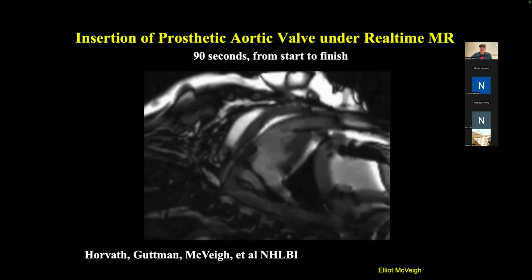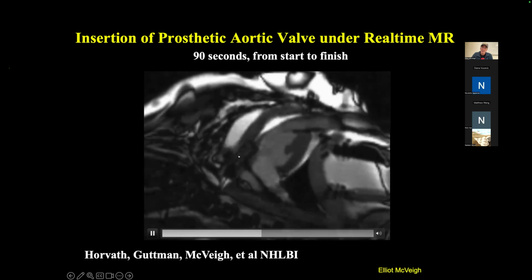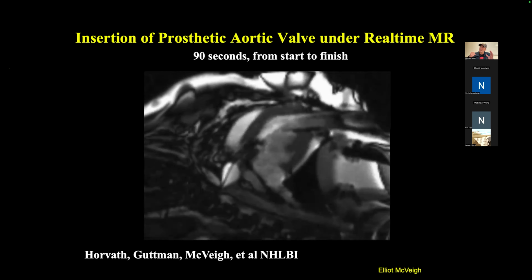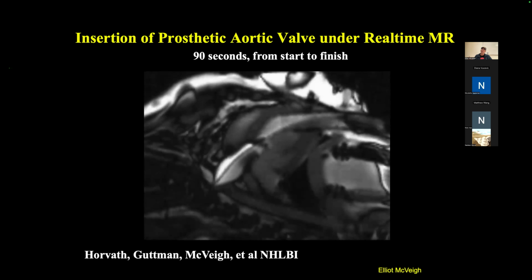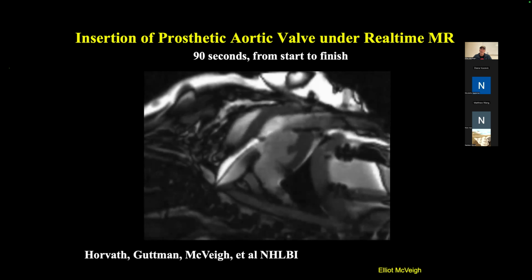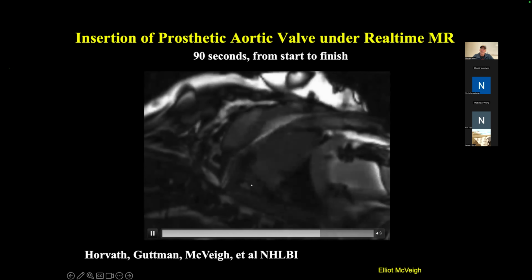Then he's going to inject fluid into the balloon that is on the interior of this valve. That fluid is going to inflate the valve and essentially lock it in place to replace the damaged aortic valve that's there. This is called TAVI now, in which the aortic valve in humans comes up and around and is deployed into their valve. CT is usually used to figure out what size you want and everything like that, but this is doing it under real-time guidance.